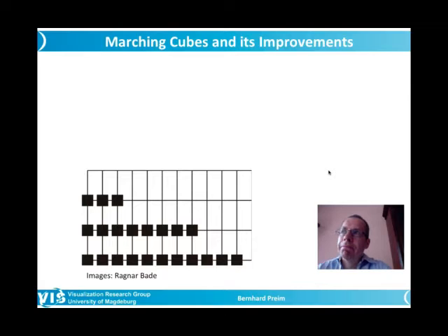And today we will continue and will look at one more algorithm for surface generation, and in particular at algorithms that post-process a surface generated with marching cubes or one of its variants in order to make it smoother. Smoothing is important because it improves the interpretability of the images. It is not just a matter of taste, it looks a bit nicer, but if you can avoid erroneous artifacts, erroneous strong edges in a surface visualization, that improves the interpretation.